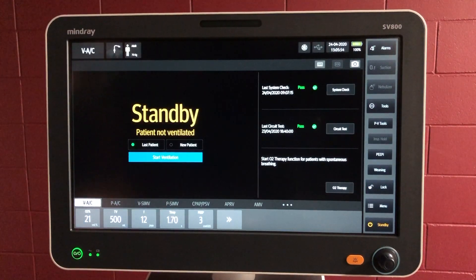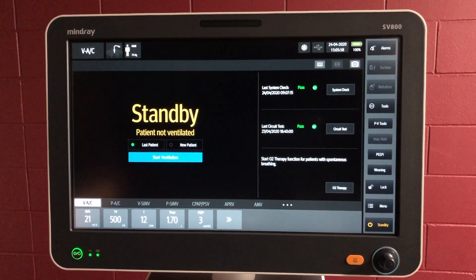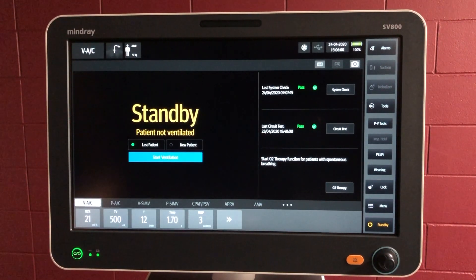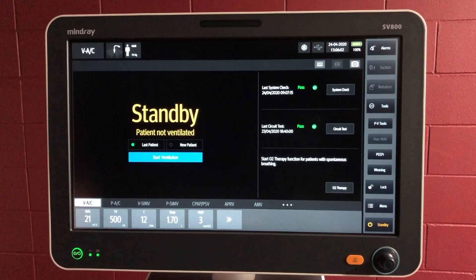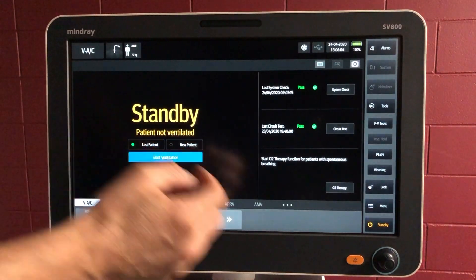The SV800 offers a range of ventilation modalities from high or low flow oxygen, non-invasive ventilation, invasive ventilation, and an automated mode as well.